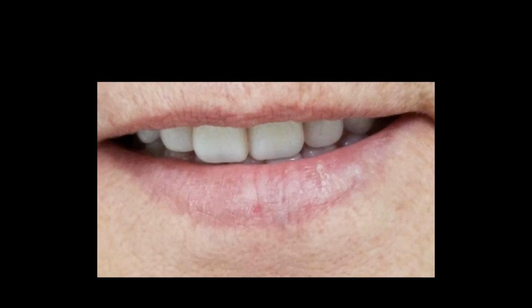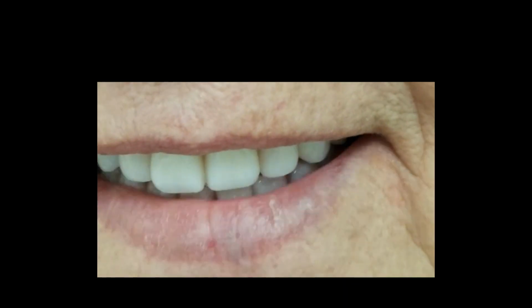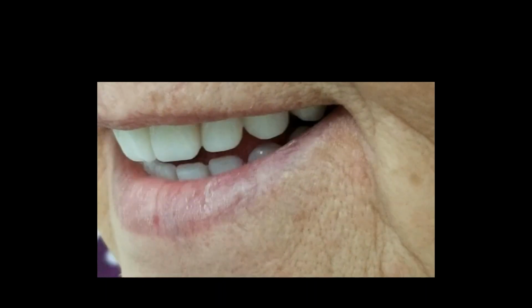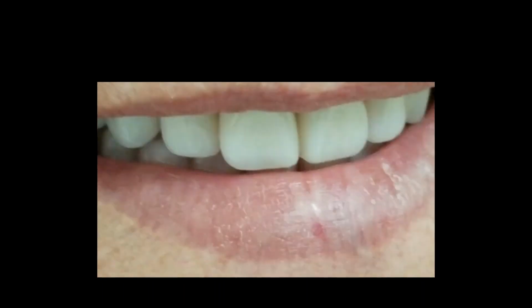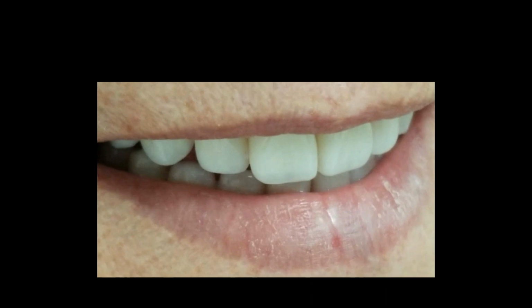I want you now to train your eye and look at the function. So take a look and see what her jaw does. Do you see it move to her left? It comes out to her left. Watch, I'll swing the camera over. Look at that move. Love it. Can you see it? So you can see her jaw's posturing forward, and then when it postures forward on 66, it also tracks to her left. Now, what am I going to do in a setup?